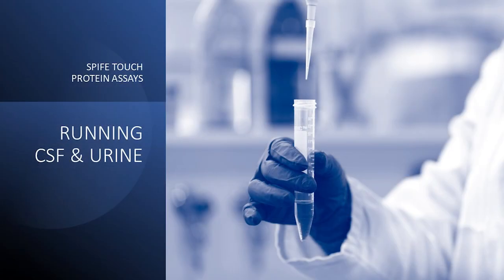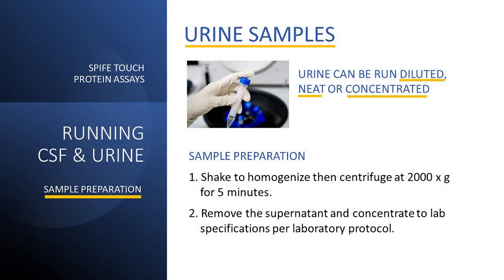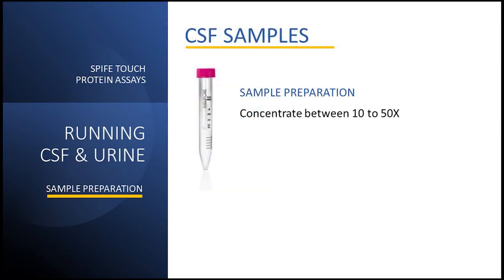Protein electrophoresis is also applicable to urine and CSF specimens, although special preparation is necessary for these samples. Urine samples may be run diluted, neat, or concentrated. Urine samples must first be shaken to homogenize, then centrifuge the desired volume at 2000 times G for 5 minutes. Remove the supernatant and concentrate to lab specifications per laboratory protocol. CSF samples may be used after proper concentration between 10 to 50x.